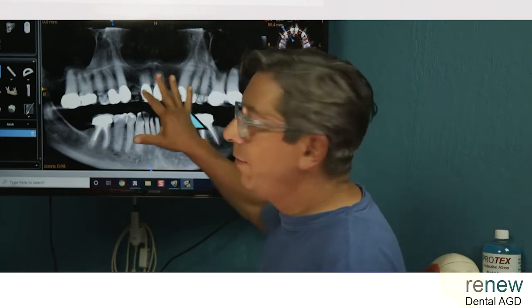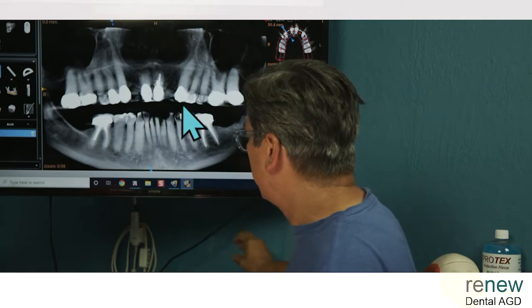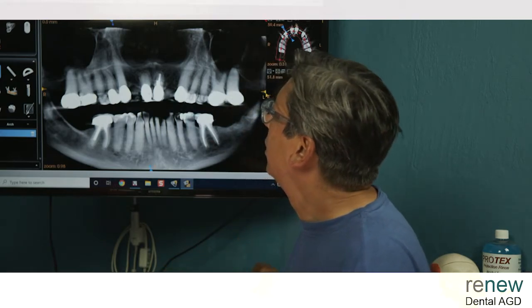Let's look at another case study. This one I call front teeth pass. If you're only working from a Panorex X-ray for doing implants, you've got to really reevaluate your next purchase on equipment, and you need to get a CT. There's no excuse today. They're cheap enough that everybody should have one in their office.